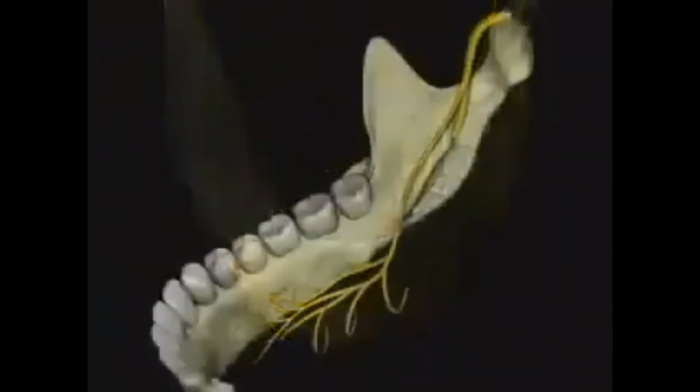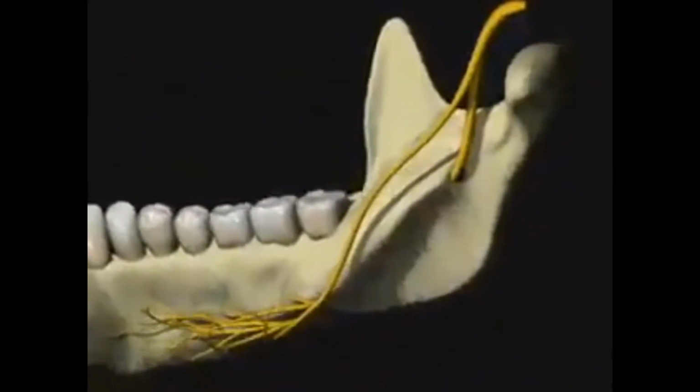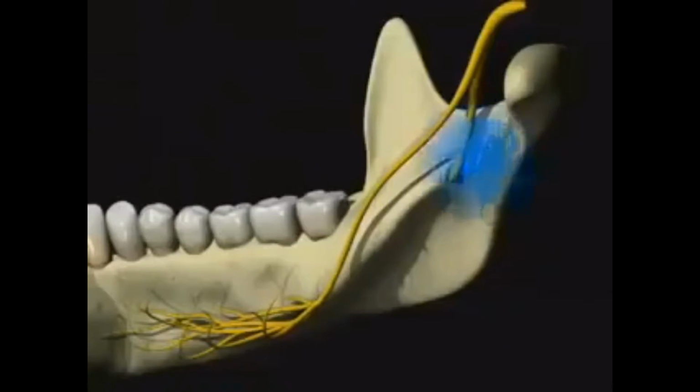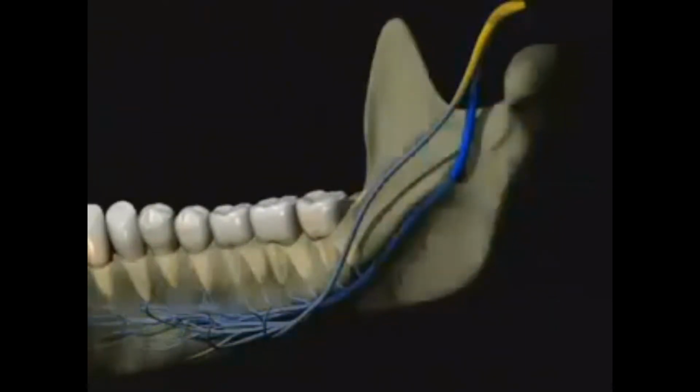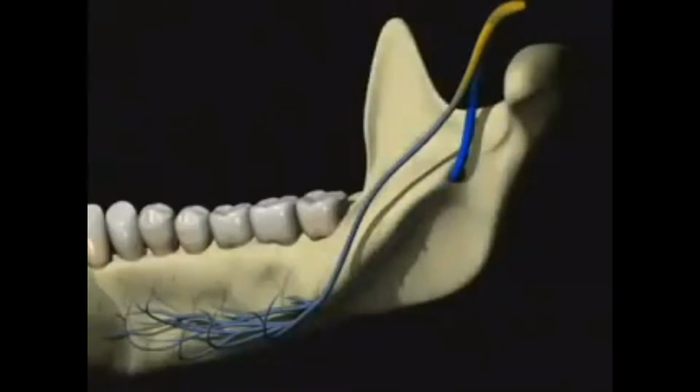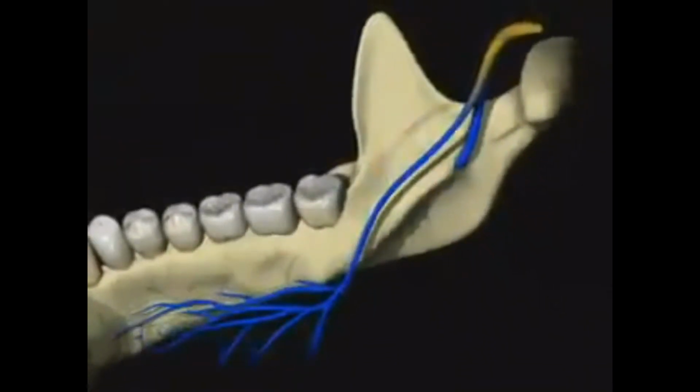soft tissues as well. The objective of this technique is to place the needle tip above the mandibular foramen into the sulcus just behind the lingula. This is where the inferior alveolar nerve inserts into the mandibular canal. The lingual nerve lies just anteriorly and medially and is often anesthetized along with the inferior alveolar nerve.